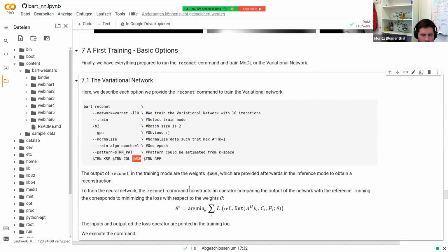Yes. So first thing, it expects you to put everything in a file. You could, with a bash script, just write a loop which loads one data set, trains for some steps on that data set, and then goes to the next data set and trains for some steps on that.